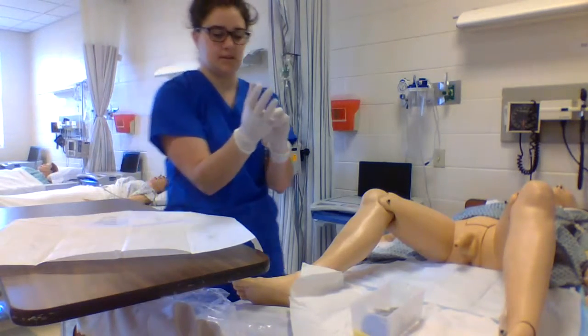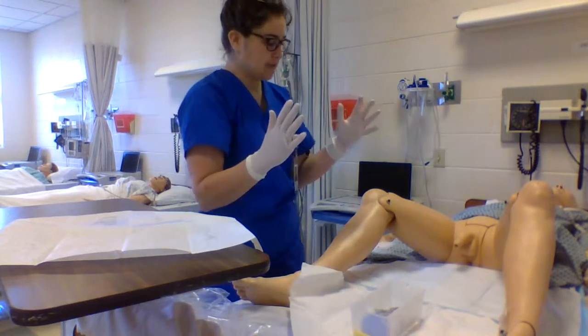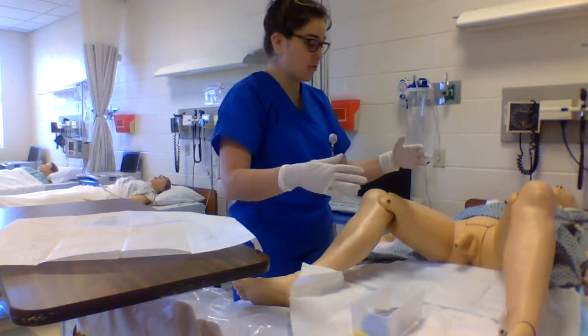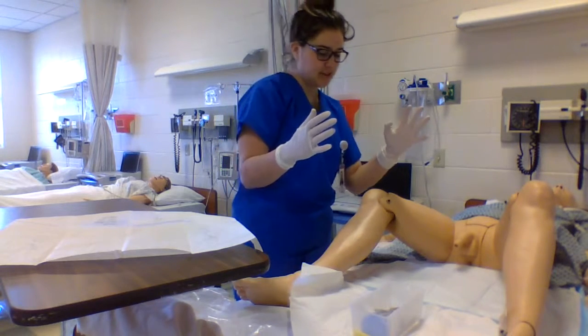So I'm going to keep it. I can adjust it as I need to. So now that I have it, I'm going to keep it out away from me, in between my waist and my shoulders, and I'm not going to cross over them or anything. So now that I've got my sterile gloves on, I can touch my sterile field.